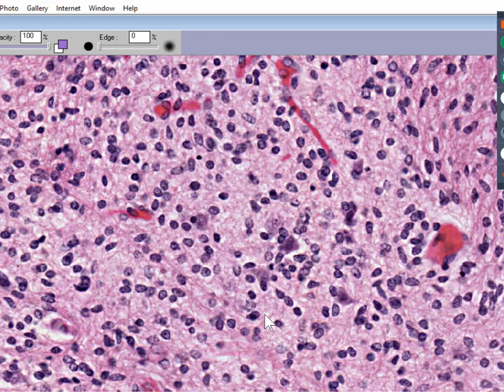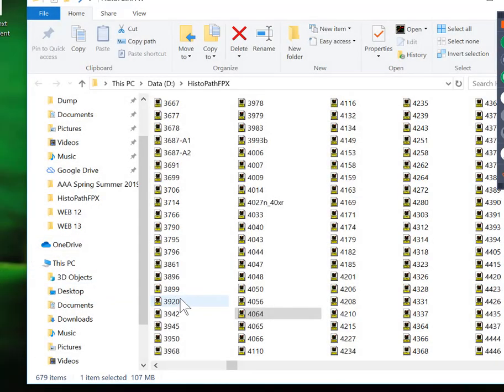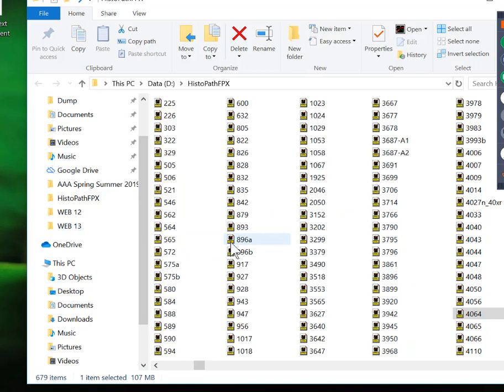Okay, here's going to be another maybe easy brain tumor. Remember, most brain tumors are of the glial cells. They are not of the neurons. So what are the glial cells? Well, you have astrocytes, you have oligodendrocytes, you have microglia, you have ependymal cells. So let's take a look at case number 927, which is going to be right here.